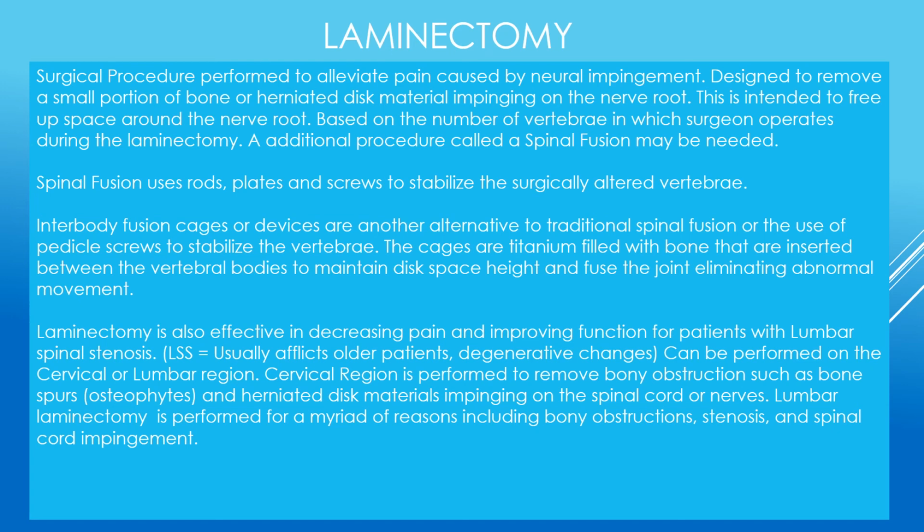Interbody fusion cages or devices are another alternative to traditional spinal fusion, or the use of pedicle screws to stabilize the vertebrae. The cages are titanium filled with bone that are inserted between the vertebral bodies to maintain disc space height and fuse the joint, eliminating abnormal movement.